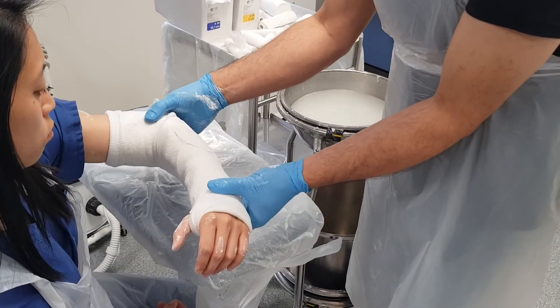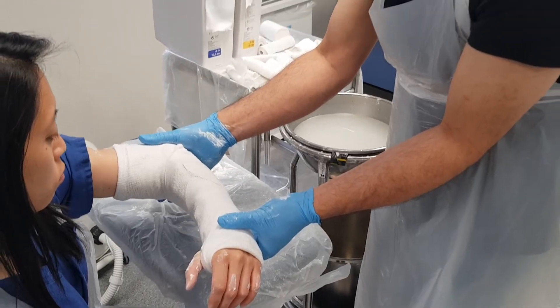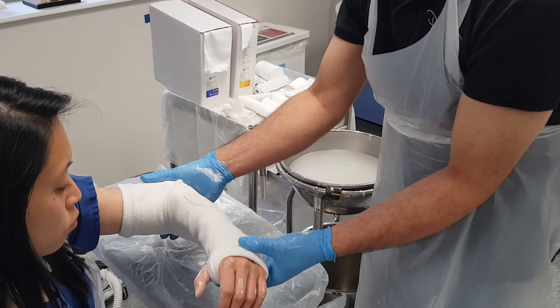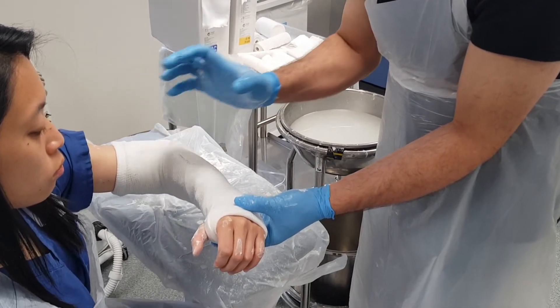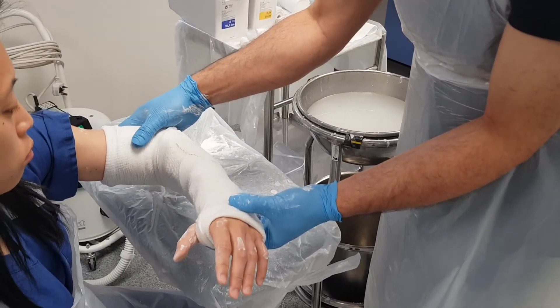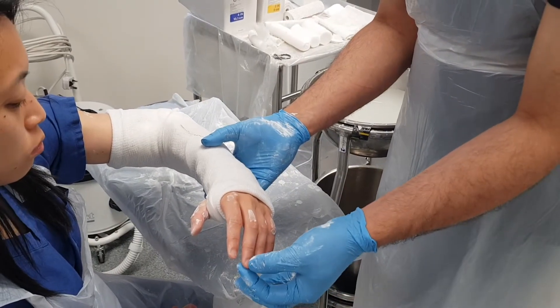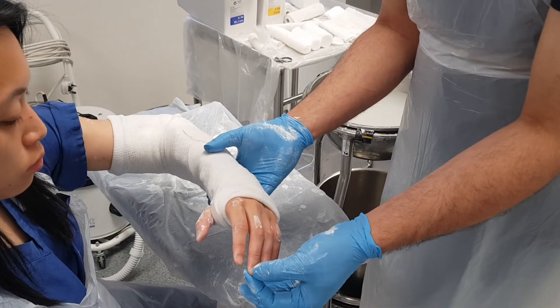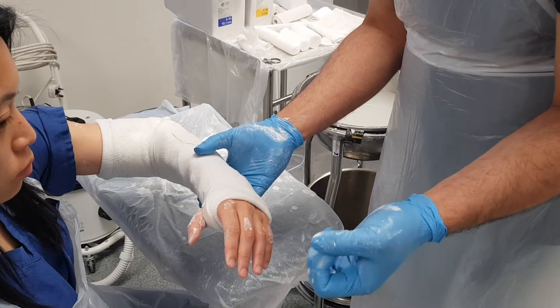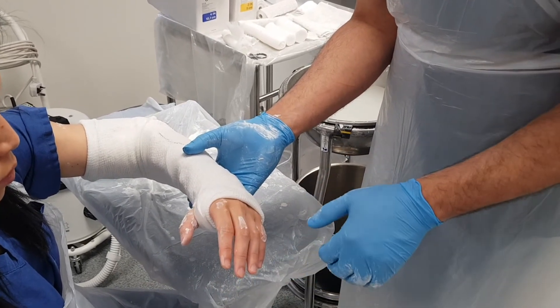So we've now got an arm which is controlled at the joints below and the joints above, and we just need to wait for this to set. We've got the metacarpal heads free — can you show me that you can bend your fingers and your thumb? Good, so I think this is perfectly fine. Then we can test capillary refill afterwards, and ask the patient if sensation is normal in their fingers and there are no pins and needles.